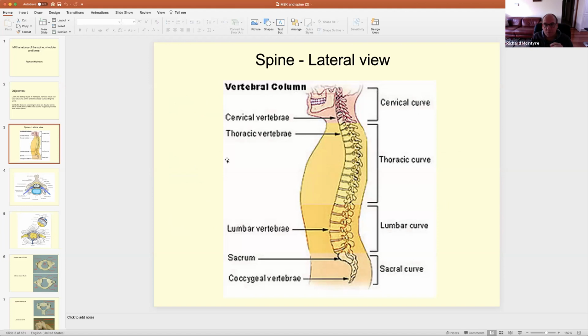So there's our vertebral column. We should all know that that's a vertebral column. It's got vertebrae, spinous processes, all the little bits and bobs around it. And I believe Peter, if he hasn't already, will take you through mainly the bony structures that we see on CT. We see bony structures on MRI, but not very well.